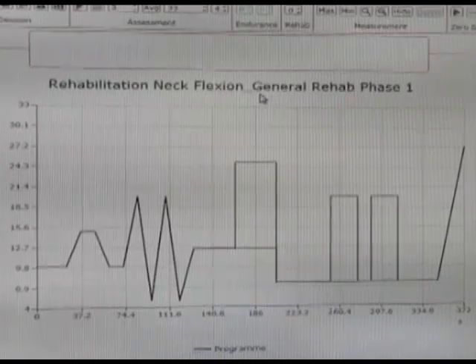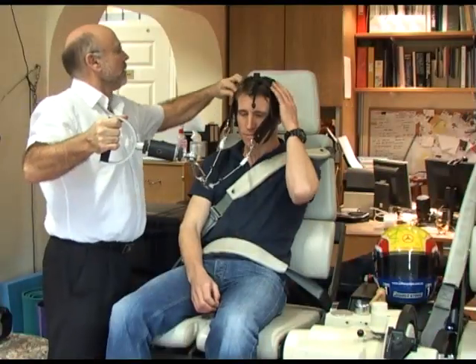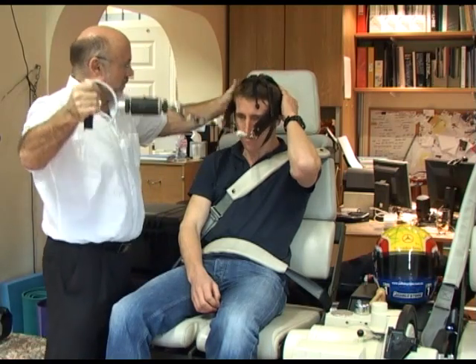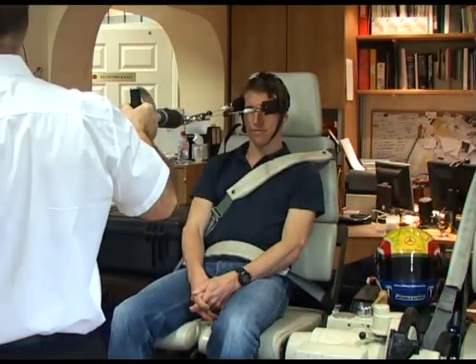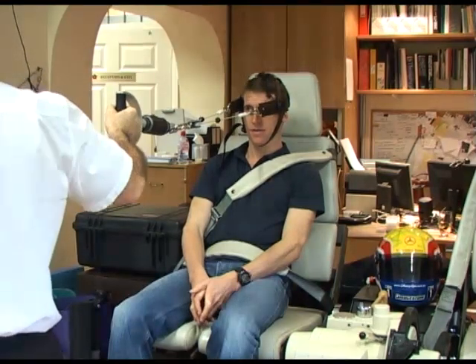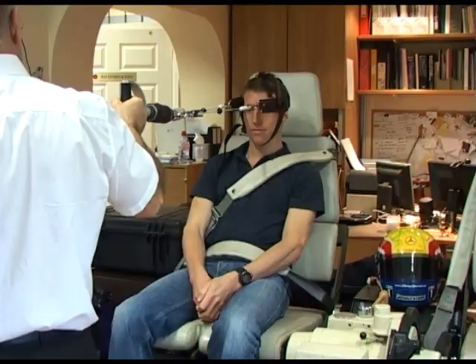Once we've applied the forces and measured the amount of force that each part can generate — for example, the neck — we can test all the actions and see if there are any deficits. You may well get a deficit between the left side and right side. We'll have a record of that, which means we can then target those deficits in a very specific way in our rehabilitation.